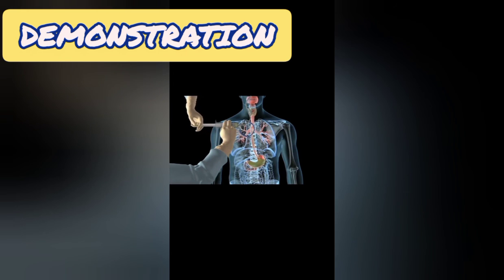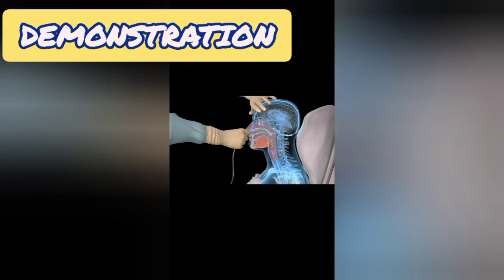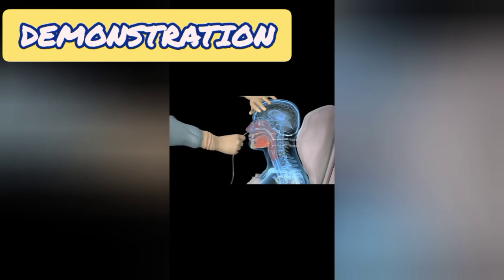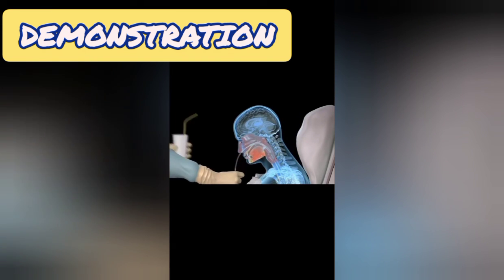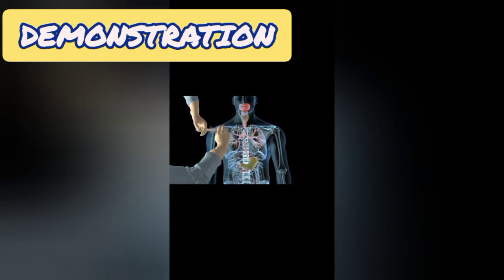Also, we can listen with the help of a stethoscope for the whoosh sound as 10 to 30 ml of air is insufflated through the nasogastric tube. However, sounds may be transmitted to the epigastrium whether the tube is positioned in the lung, esophagus, duodenum or proximal jejunum. So with the help of a stethoscope we can hear the sound. Mainly a hissing sound is heard.